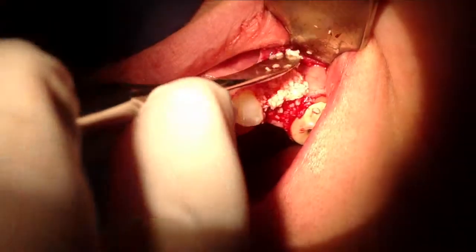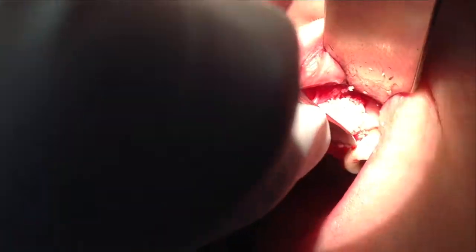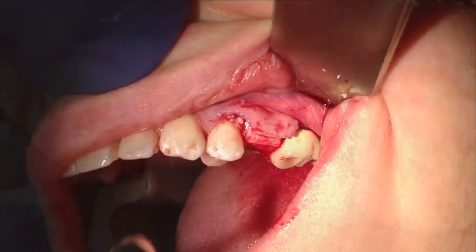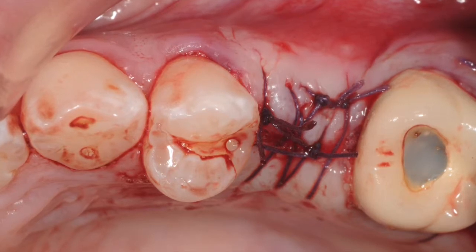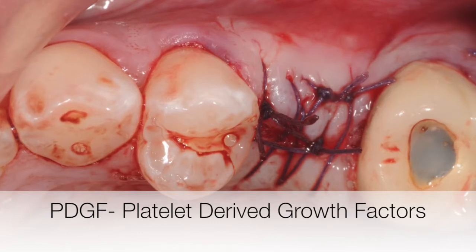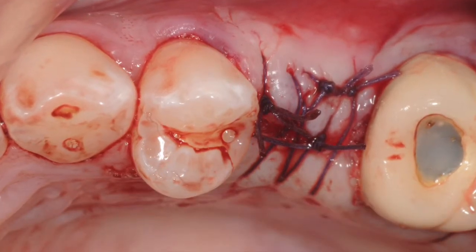Next, mineralized freeze-dried bone was packed into the site, with caution not to extend it beyond the sinus floor level. The lateral aspect was also grafted further and covered with a resorbable GTR membrane. For closure, a very small amount of periosteal scoring was necessary to release the flap and allow tensionless closure. PDGF is highly recommended in such cases, which helps with the healing process and maturation of the soft tissue. The site is allowed to heal for about four to six months before a new implant is placed.